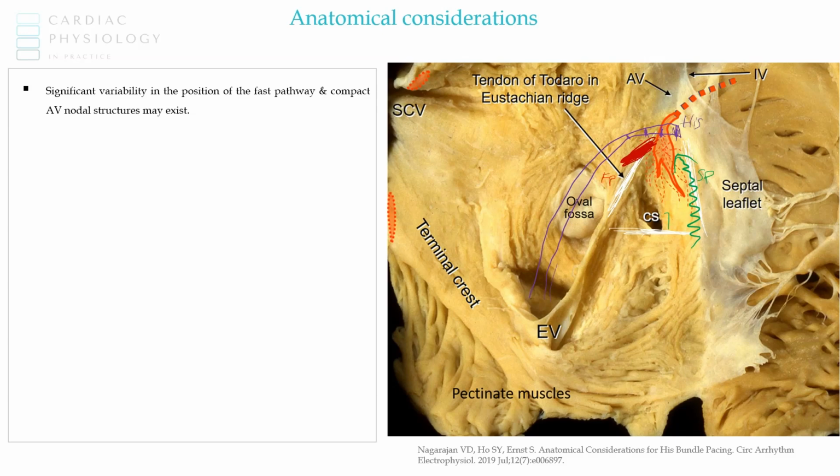So it seems simple then to place an ablation catheter anterior to the coronary sinus ostium, but posterior to the septal leaflet of the tricuspid valve, where you have a 1:3 or 1:5 A to V amplitude ratio, perhaps with some fractionated electrograms representing disrupted fiber orientation and disrupted conduction through this region. Start radiofrequency ablation and drag the ablation catheter towards the coronary sinus ostium, and hopefully we take out the slow pathway.